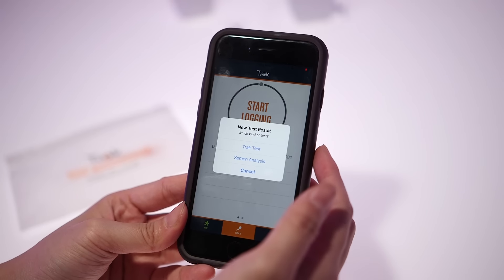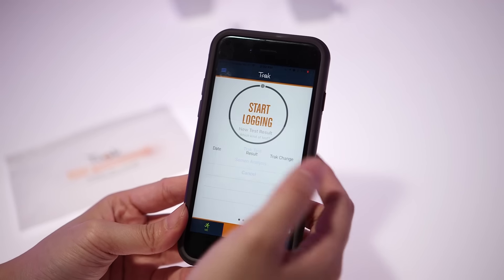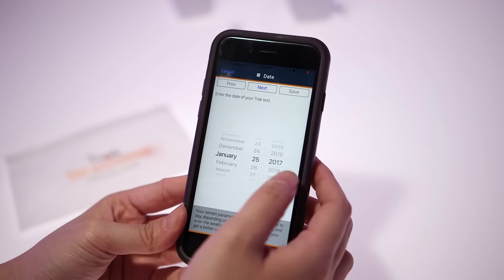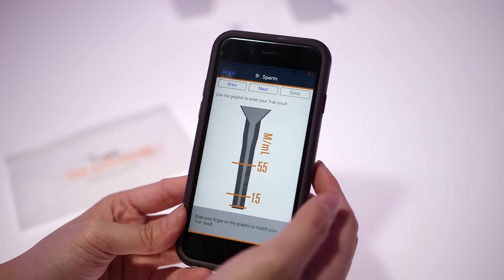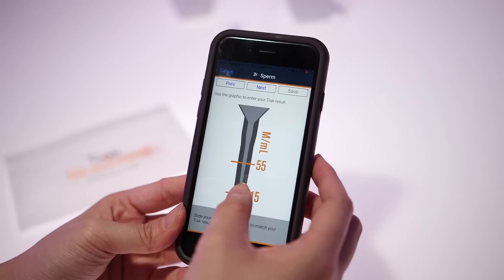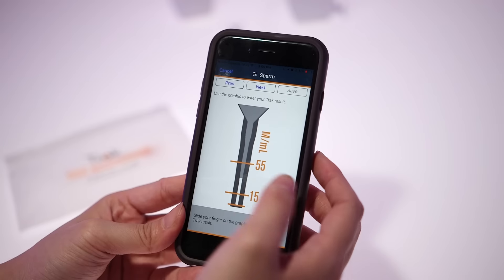Here's why the range I mentioned earlier is important. Instead of simply telling you whether or not your production is adequate, TRACK tells you where you stand on a scale of low, moderate, or optimal based on guidelines from the World Health Organization.